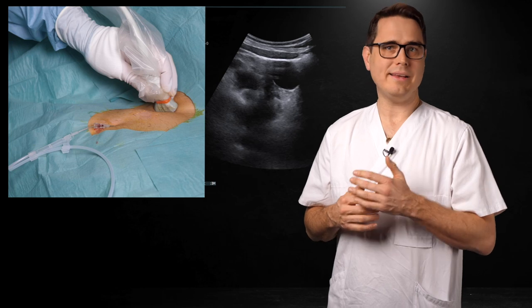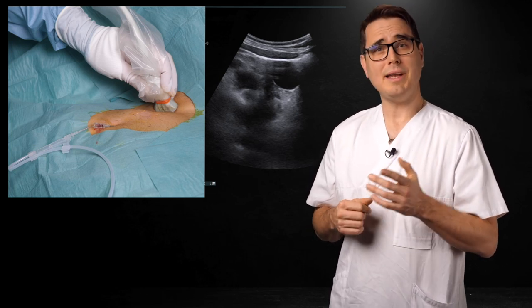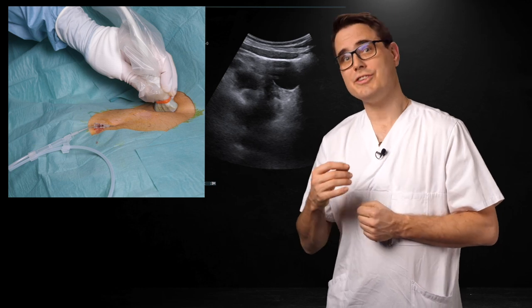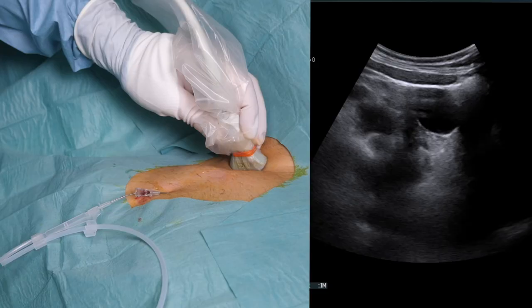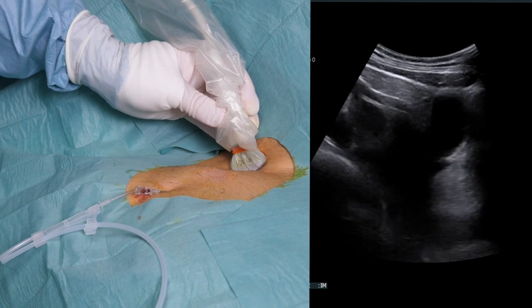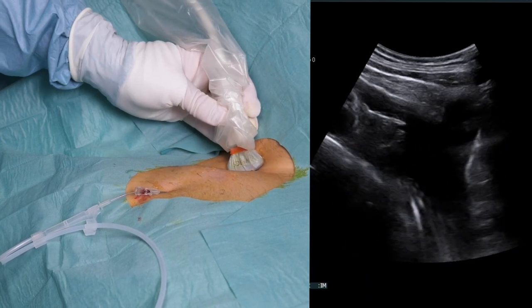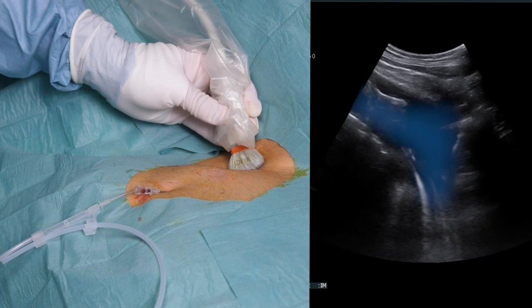You can find the same view when placing a subclavian line. Use the short axis view of the IJ, but first you need to confirm that you don't see a hyperechoic dot, as that would indicate a cranially deviating guide wire. Tilt caudally until you see the guide wire entering the brachiocephalic vein from the left, then proceed by looking towards the right atrium and increasing the depth.